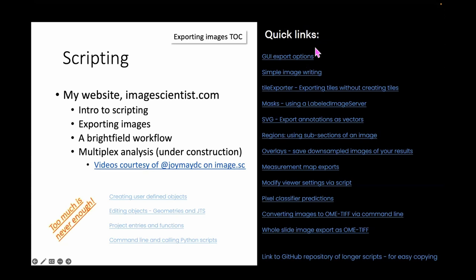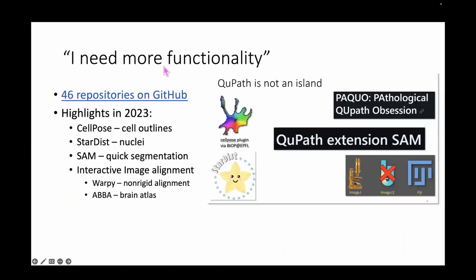There's also an entire section on exporting images — probably the most commonly referenced section. When people ask why it's not easy to just export an image, it's because there are many ways to export: creating a mask that's class-based, or instance-based where every cell is a value of 1, 2, 3, on multiple layers for different classes. This goes through most of those cases, though I probably need to add a section on density maps because there was just another forum post recently about exporting density maps as images.